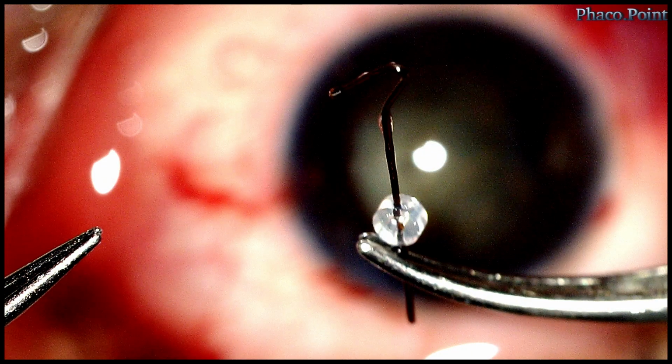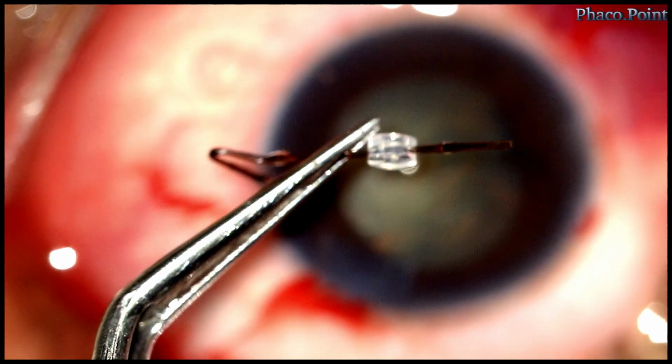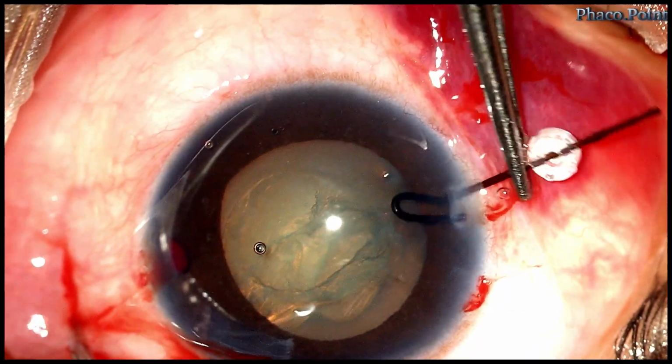Let's now learn how to use the capsular hook in cases of zonular dialysis. As compared to the iris hooks, you will note that these hooks have a large hook which is fairly long, and the end of it is blunt so as to not damage any part of the capsular bag.